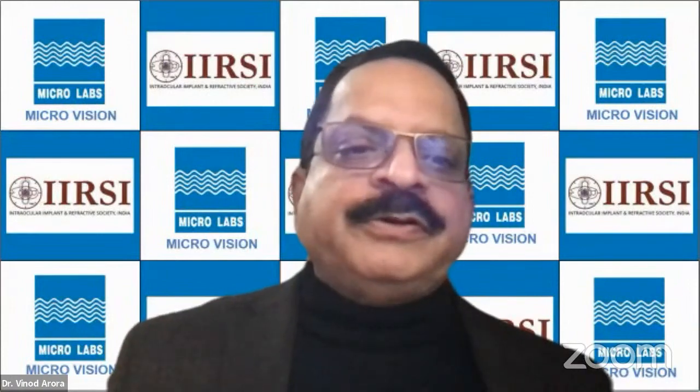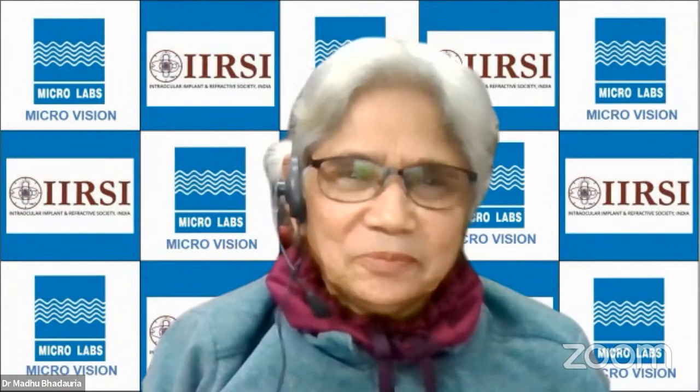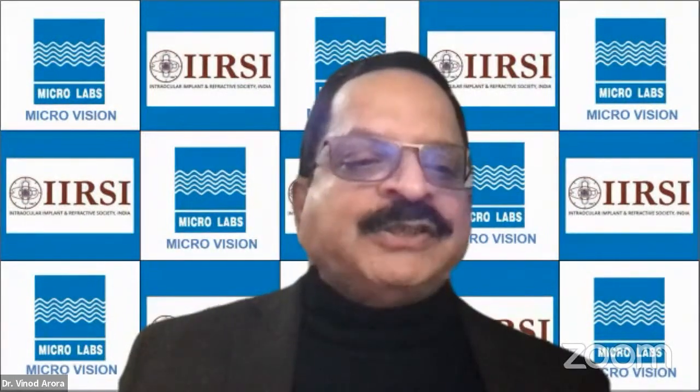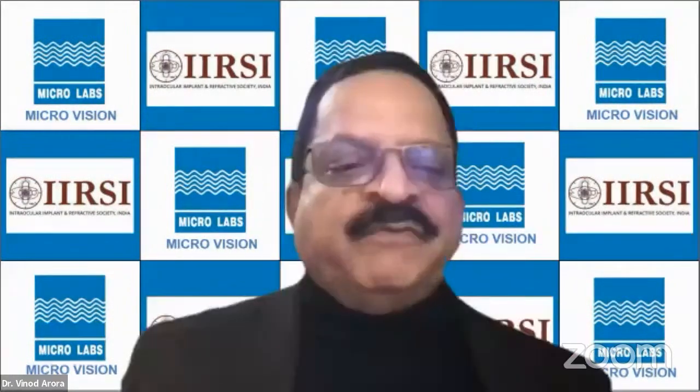Subconjunctival only. Some people do it, but it's not so comfortable. Let's be fair, some people are even putting MMC with subconjunctival also. So it's not very comfortable. Patient may not be comfortable at that time.